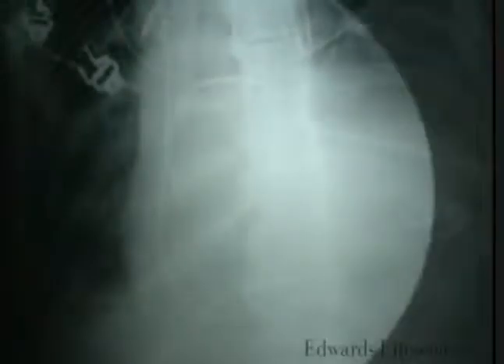It has a technical limitation because the patient's left shoulder is turned toward us, but in fact you can see the catheter tip way out to this position. The first thing I would do if I saw a radiograph like this would be go back to the bedside, check the centimeter markings on the catheter, and see if the catheter is wedged permanently, or if not, how much air it takes to wedge the catheter, and then reposition as is appropriate.